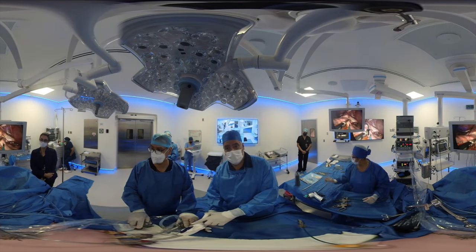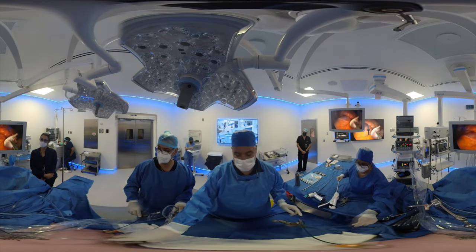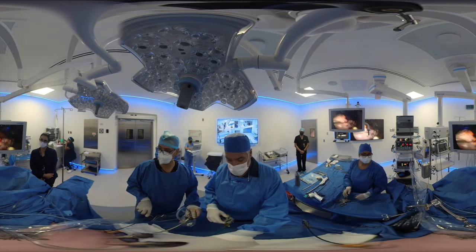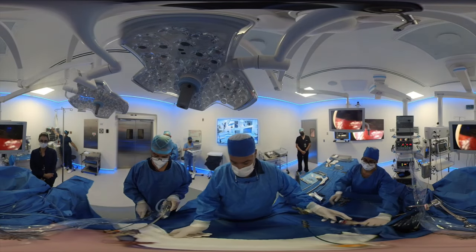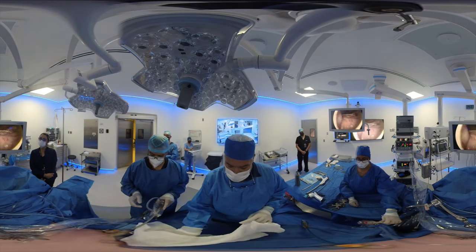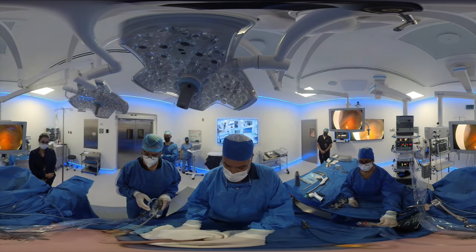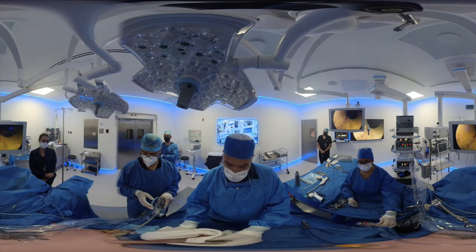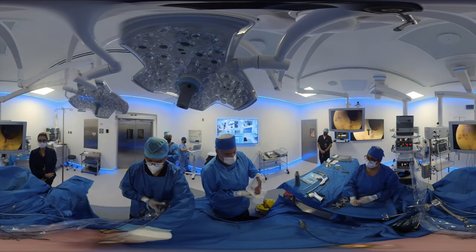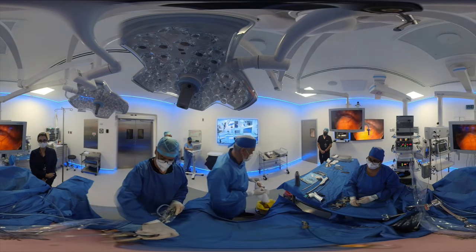You'll see that we have several instruments inserted in the patient's abdomen. These instruments are called trocars, and these trocars basically keep the gas inside. I want you to scroll down to the patient's abdomen because you're going to see that I'm pulling the patient's stomach — a partial stomach that has been divided — through the skin and through the abdominal wall. I'm holding it now and I'm going to ask my assistant to inflate it so you can see exactly how much stomach we removed.